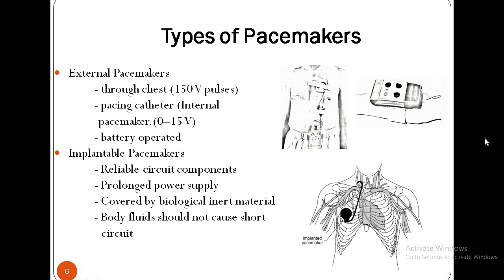The disadvantage of external pacing is that the electrodes eventually tend to burn the skin and the electrical pulses become painful. Also, each impulse causes an uncomfortable contraction of the thoracic muscles around the area of the electrodes.